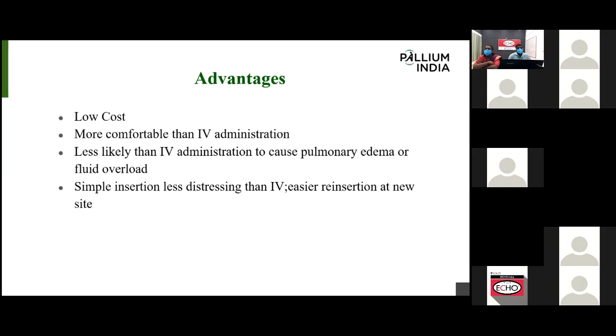First one, it's low cost, because as I already told, we mainly use a butterfly cannula, or as we said, we use it as a needle. Compared with IV cannulation, this SC set is comparatively low cost, and the accessory items are also comparatively low cost. Then it is more comfortable than IV administration for the patient and for the staff also.